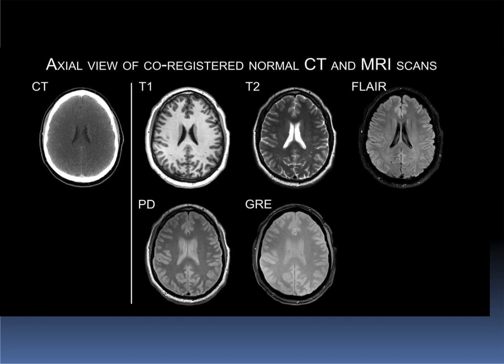Gradient echo sequence, GRE, is used in hemorrhage and calcification. The proton density.